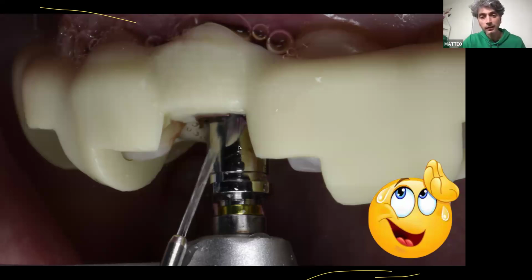But if this drill gets inside the sleeve in this way, no problem. It's 2.8 drill. It's a yellow one. It's very sharp, and you can go.